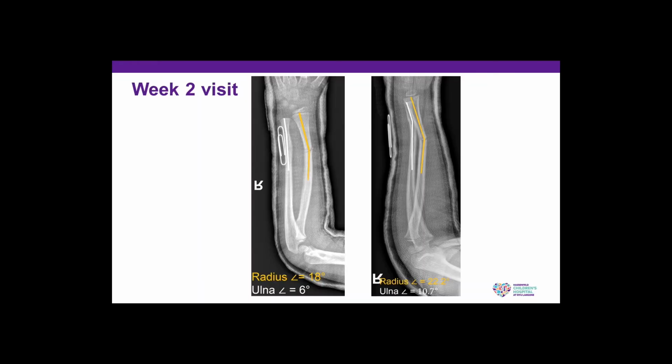However, at the week 2 follow-up visit, the fracture's angulation had again worsened, and now the fracture was considered to truly be redisplaced. At this visit, sagittal angulation had increased from 16.2 to 22.2 degrees, and the decision was made in consultation with the patient and her family to wedge the cast to improve its alignment.